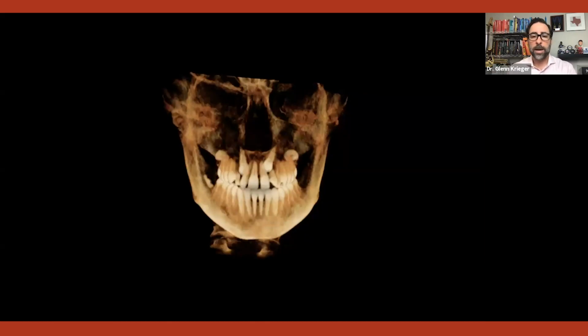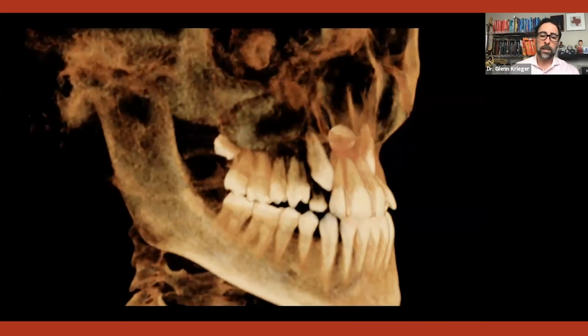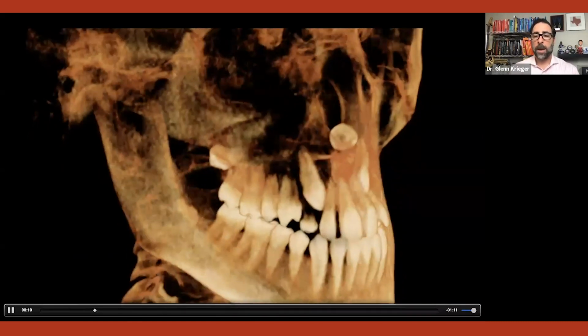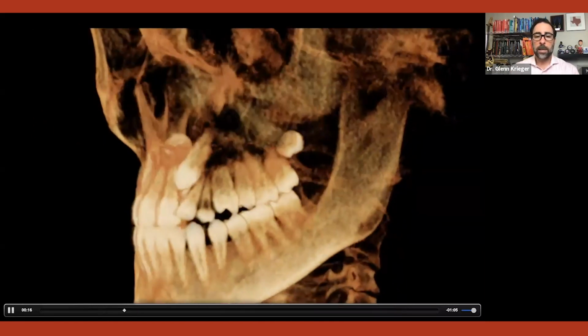So how are we going to treat this? Well, again, let's go back, as Blue's Clues used to say, to our handy dandy CBCT. And let's just look around and see what we've got here, right? So on his right side, nothing really too remarkable in comparison, right? We have a cuspid that looks to be resorbing the primary cuspid root. Everything looks to be going pretty well. We come over to the left side cuspid, and it's in a funky place.